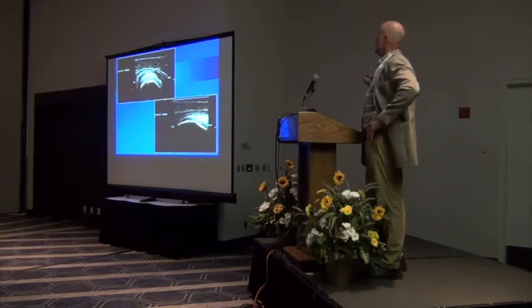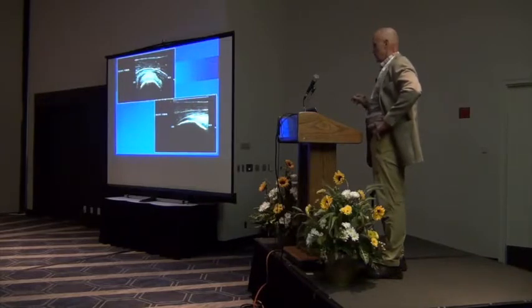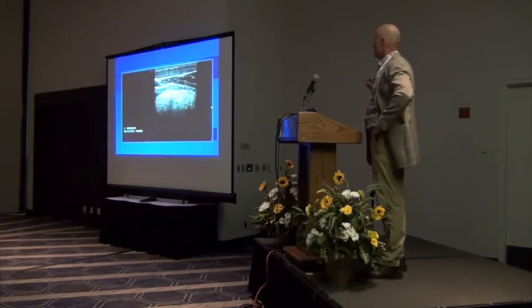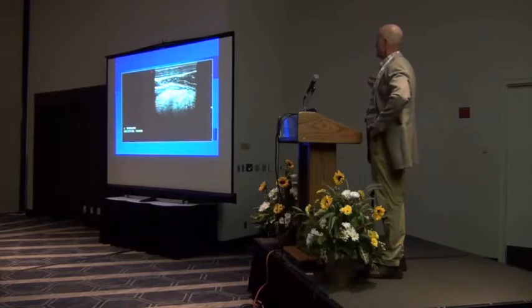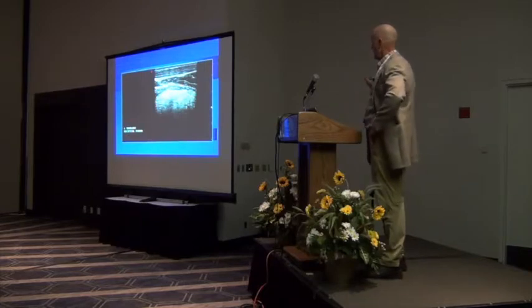Here's the supraglenoid tubercle. Here's this semicircular attachment, and then this is what it looks like. That's transverse view. This is longitudinal view. And there is the occasional enthesis change that we'll see at that location. This is just below that. You can see it's very heterogeneous, and sometimes we can't get a really good look at the caudal border of the biceps tendon. Here's brachiocephalicus on top of it.